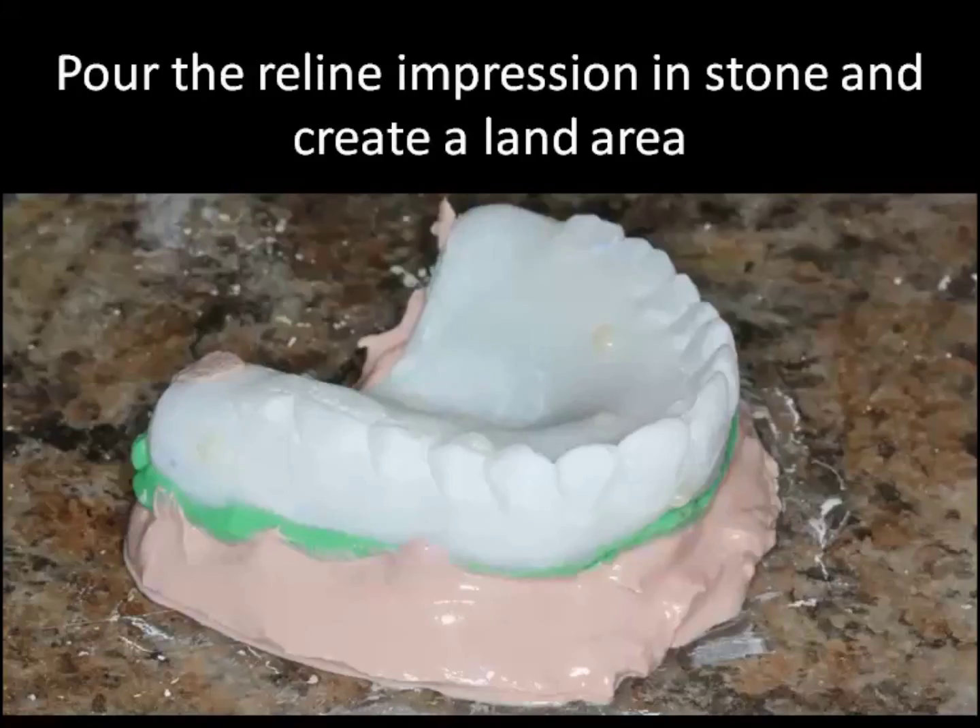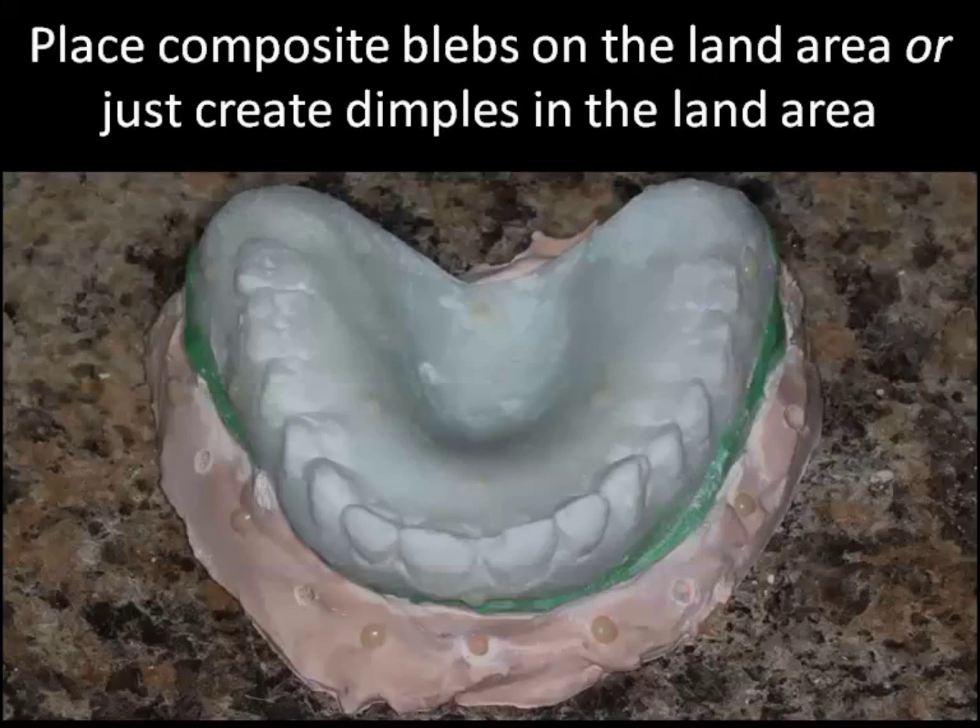You'll scan your patient with the radiographic denture in the mouth, then take the denture out and pour it up in stone as you can see here. Make sure when you pour this that you do create a land area all around the denture. We're going to allow that to set, and then once we have that model set we're going to come back and place some flowable composite blebs on the land area.